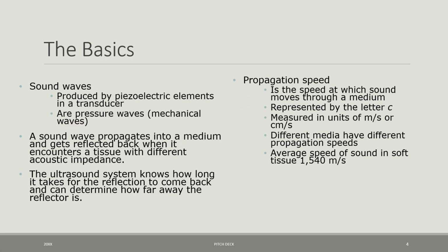So the basics of sonography: we know that sonograms, ultrasounds, our images with sonography are produced by sound waves. Our sound waves are emitted by a piezoelectric element within our transducer. That piezoelectric element, when it gets stimulated by a voltage stimulation, will expand and contract, creating a mechanical motion, which in turn creates this mechanical sound wave.